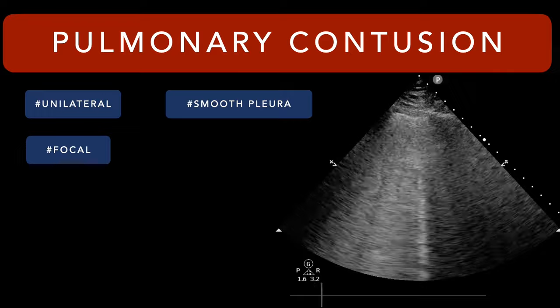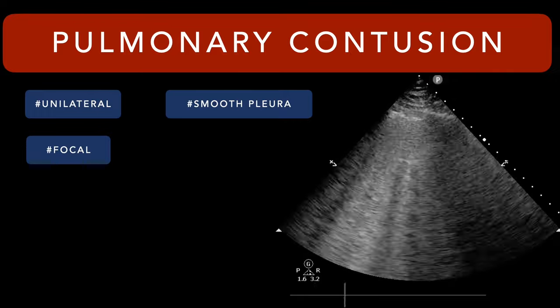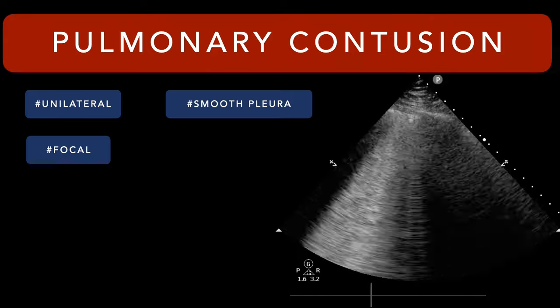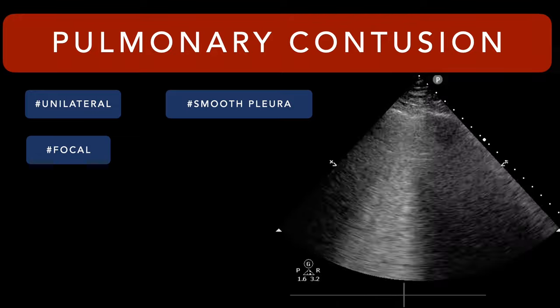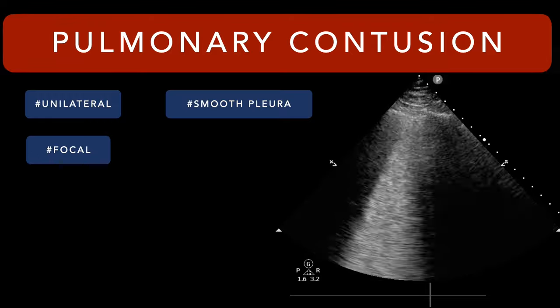And I think if you take anything away from this, understand that B-lines don't automatically equal pulmonary edema, right? B-lines equal anything that causes thickening of that interstitial space. And then from there, you need to use your clues in your ultrasound, your clues in your clinical story to then help narrow that differential down to what you think is actually going on. Right. So that's part two, right?